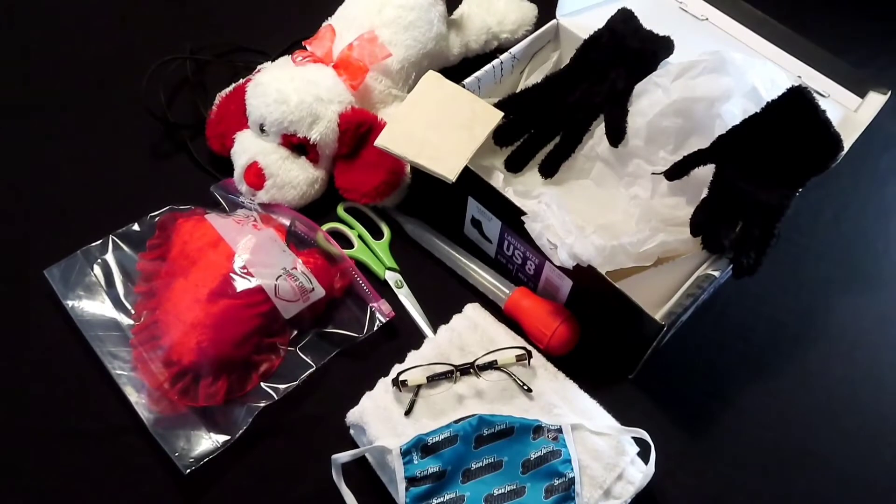I put together these props to help you understand what equipment you might need in lieu of the actual pre-hospital childbirth mannequin and OB kit. Look around your house. Perhaps you could put together your own kit so that you can practice while watching the pre-hospital childbirth video.